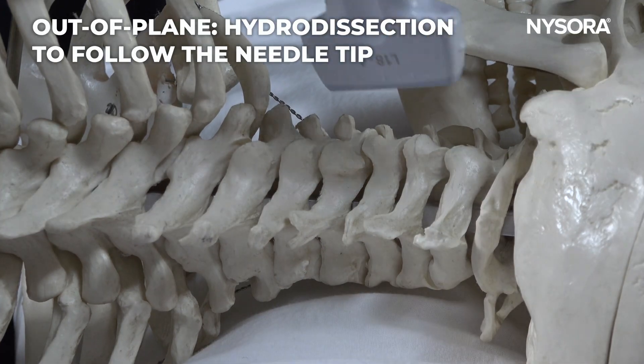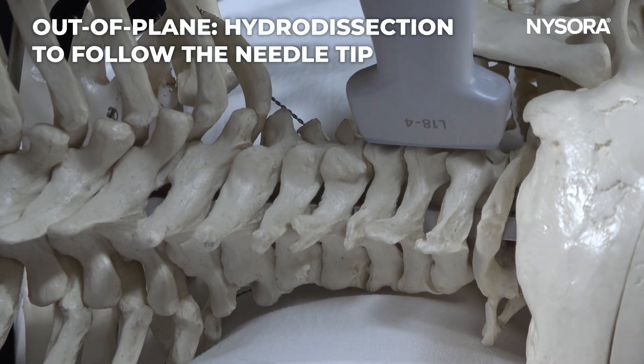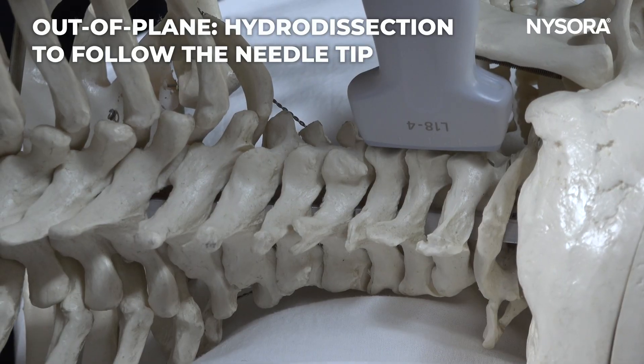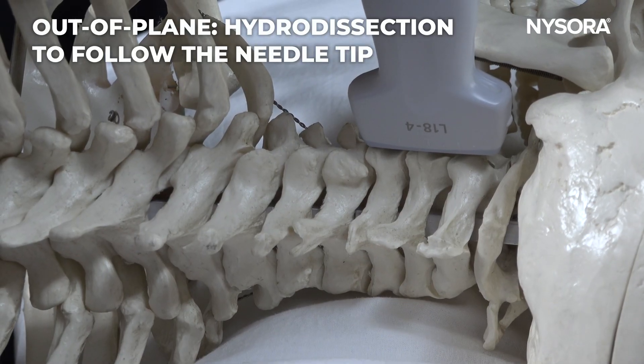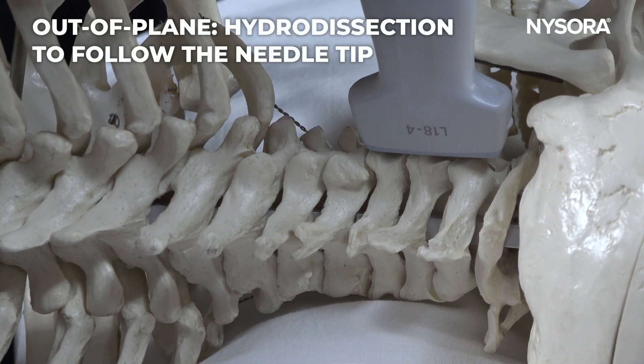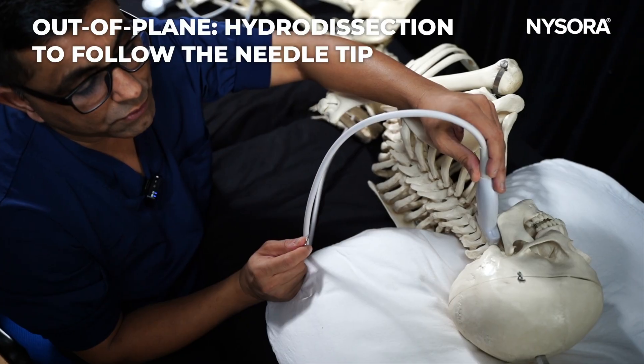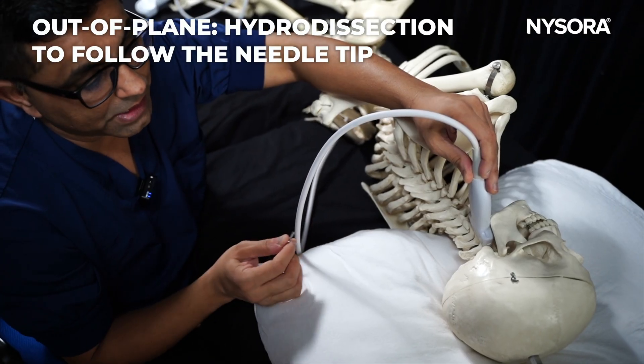When using the out-of-plane technique with the longitudinal approach, you need to use hydrodissection to chase up and confirm your needle tip position.